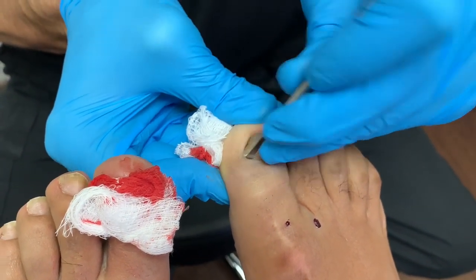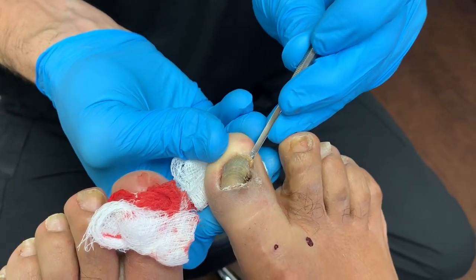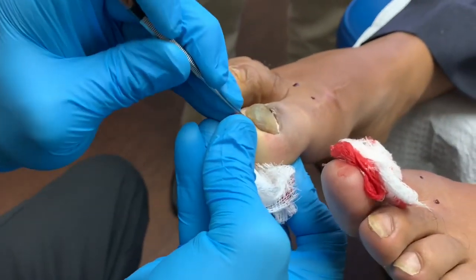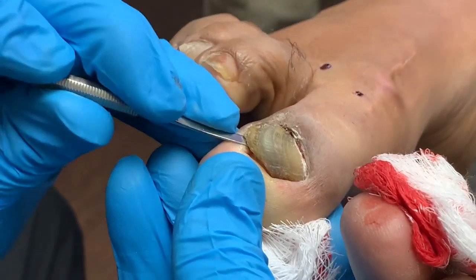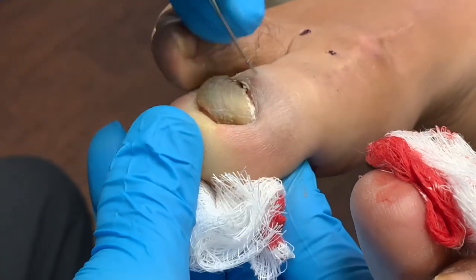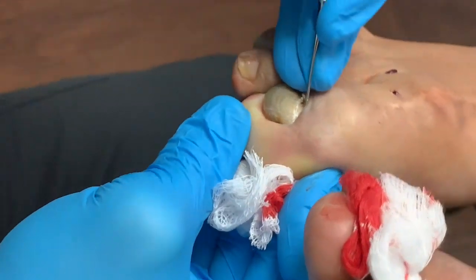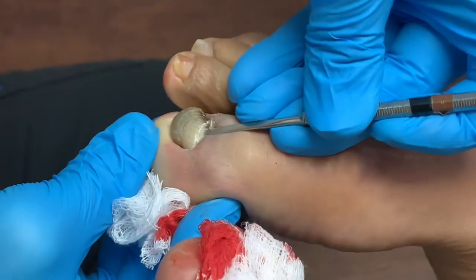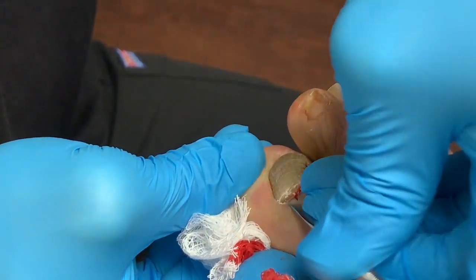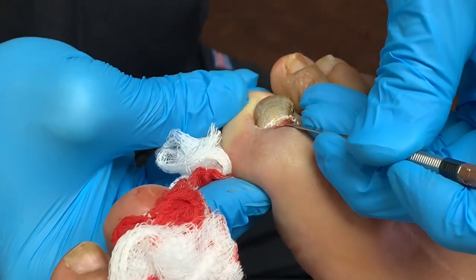Look at this — this one has adapted tremendously. Look at how this is just digging in there, and it's very deeply embedded.